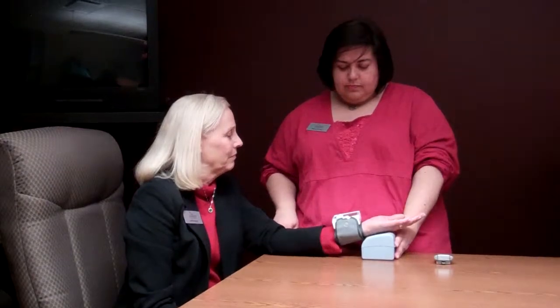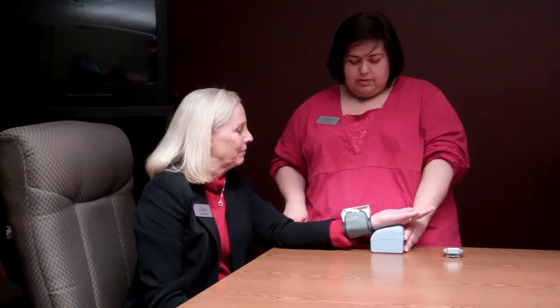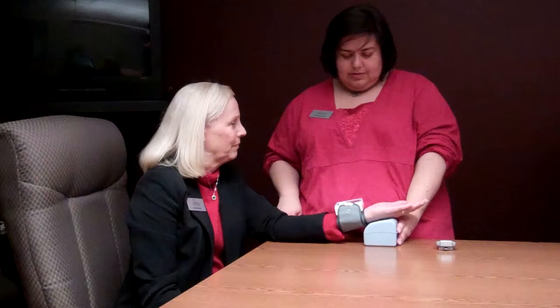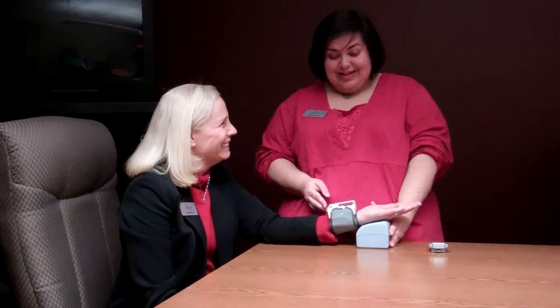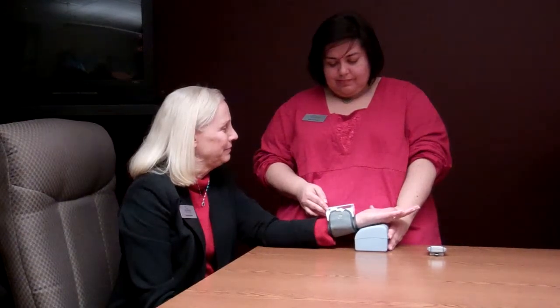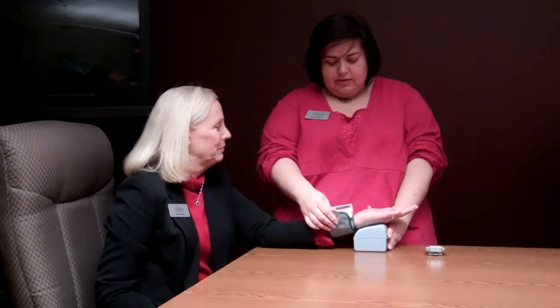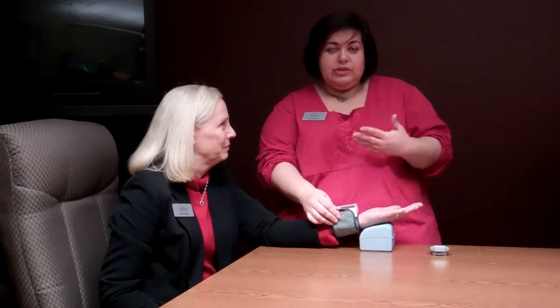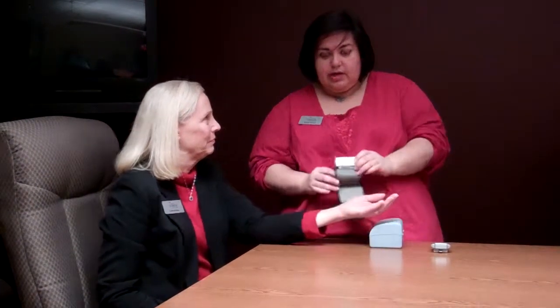Your measurement data is: systolic pressure 144, normal high; diastolic pressure 76, normal; pulse rate 65. Then you power it off — and that's all there is to it. It will store the data so you could give it to your doctor later so they could have a record, or it will just repeat it if you're recording it on a chart.